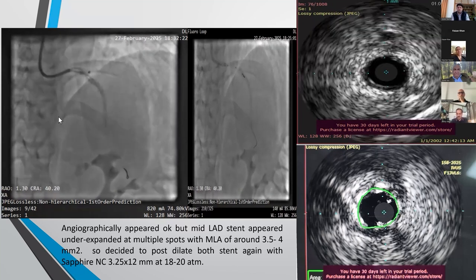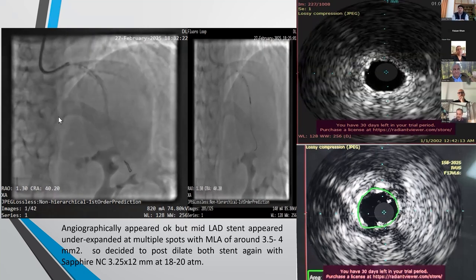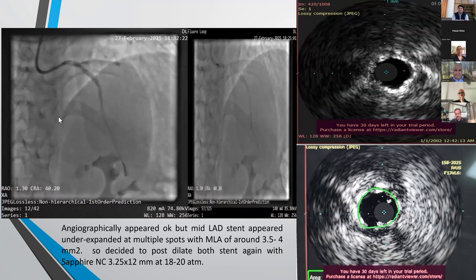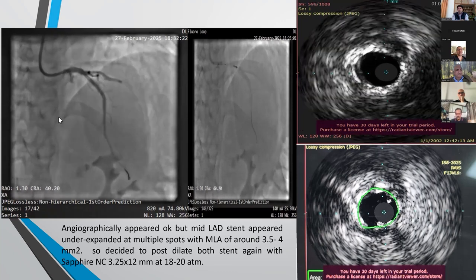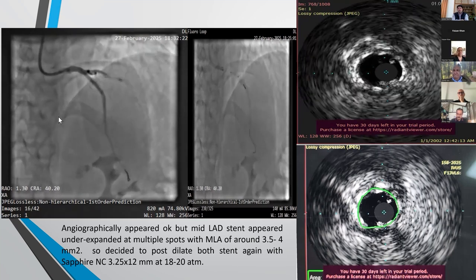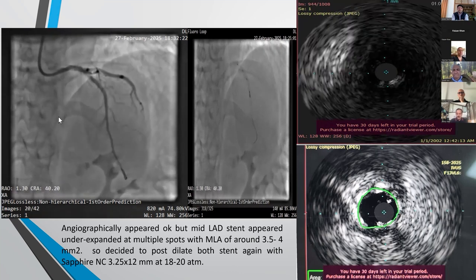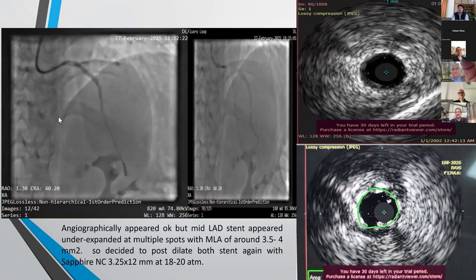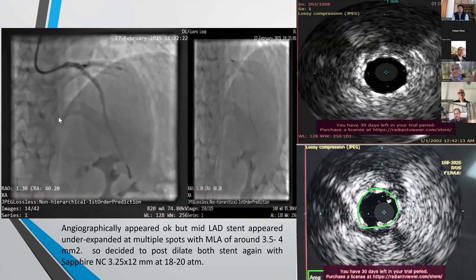Yes, that'll be crucial, to have strict parameters: what the testing should be, what routine testing they're doing pre-cath, and what the sterilization process is if reuse is allowed. The patient should be consented and informed about that as well. And obviously the cost will be much lower for them, or free, if it's reuse approved with proper guidelines. So I think we have had a good, interesting discussion on IVUS and imaging, and hopefully these sessions will encourage more frequent use of this, since it's a class 1 recommendation in both ACC and ESC guidelines for left mains and complex bifurcation stenting at least.